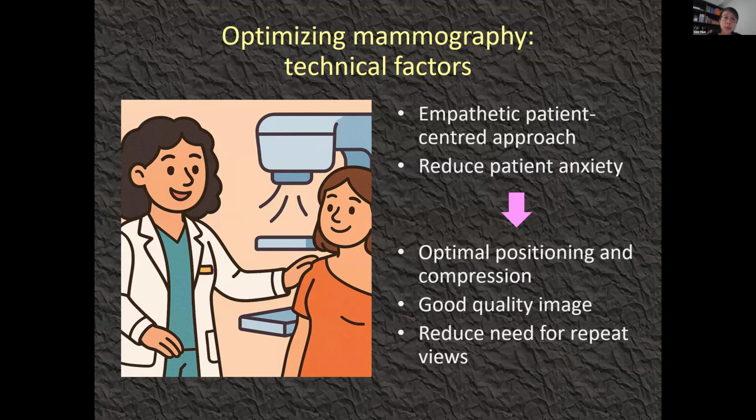Technologists play a very important role in the patient's journey. An empathic and patient-centered approach is very helpful to reduce patient anxiety. And when the patient is more relaxed and calm, she's able to cooperate with you much better. Then the technologist is able to perform optimal positioning as well as compression, and this leads to a good quality image and reduces the need for any repeat views, therefore maintaining those to a minimum.